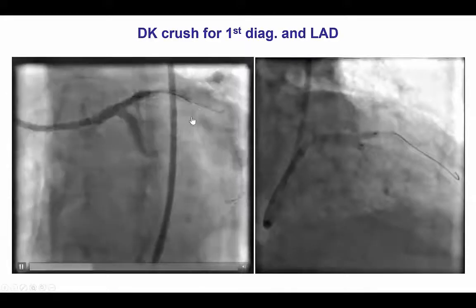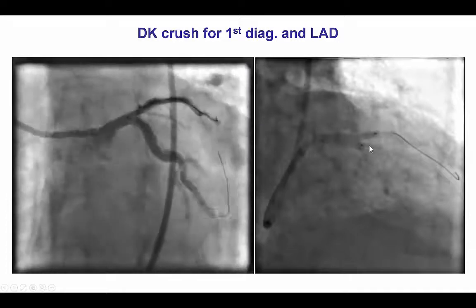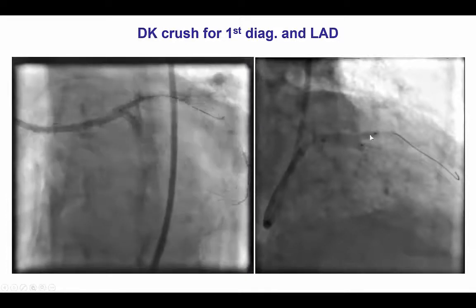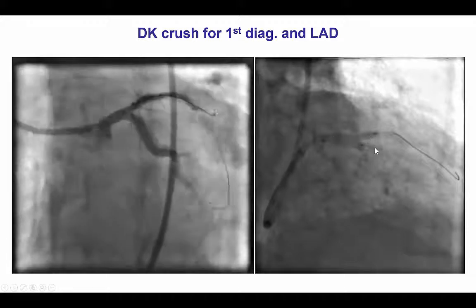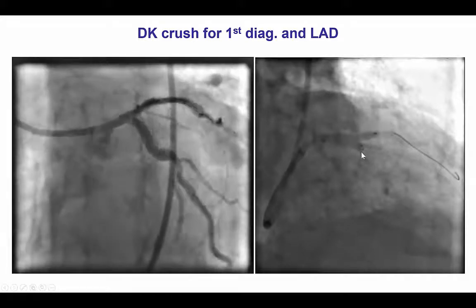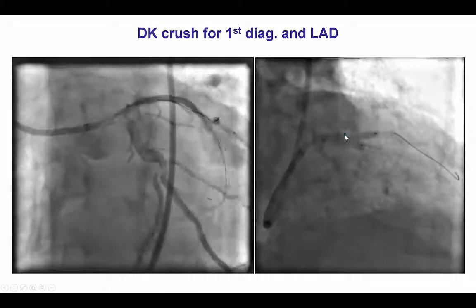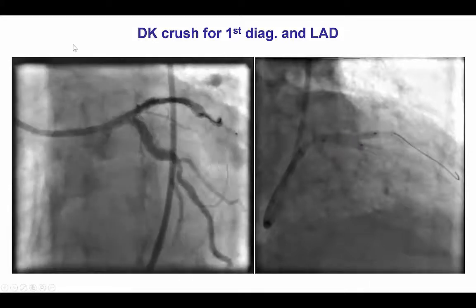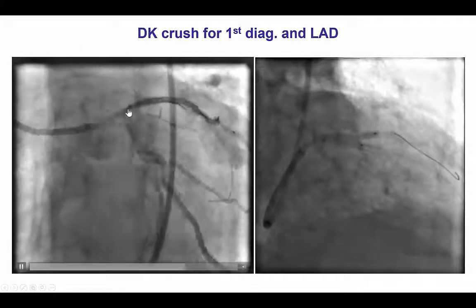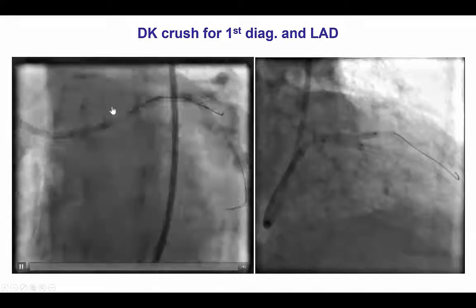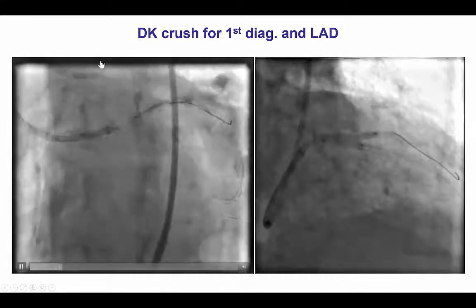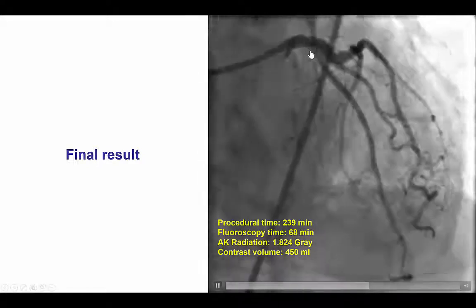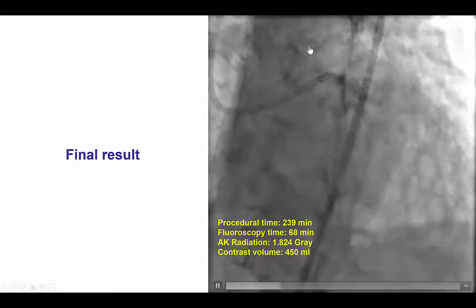We then advanced another stent into the LAD and deployed it. The diagonal was re-wired and we performed the second kiss inflation by doing high pressure inflation first in the side branch, then the main branch, and then both together. We made sure that the stent in the proximal LAD did not extend into the left main, as seen on the injection. By doing this we achieved a nice angiographic result.